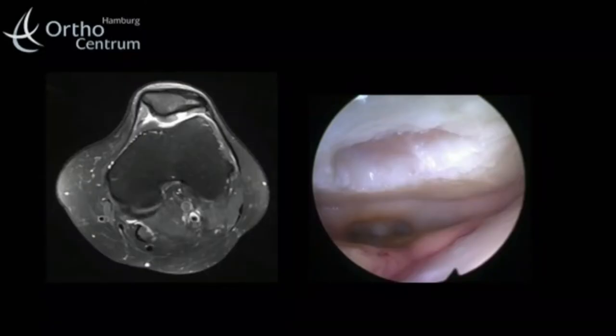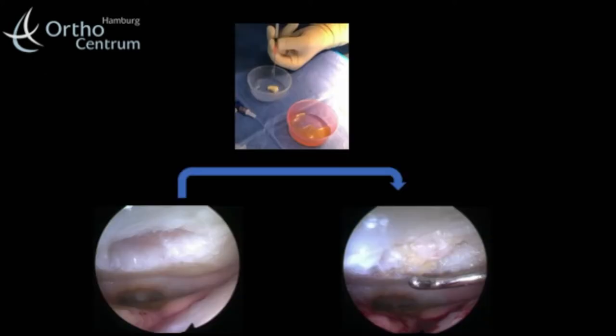In this video I used the arthroscopic minced cartilage technique. The cells to implant were taken from the defect margin, mixed with PRP, and transferred to the applicator. It should be mentioned that treatment of patellofemoral pathology — for example, with a trochleoplasty or a tuberositas tibia transfer — should precede any cartilage transplantation.